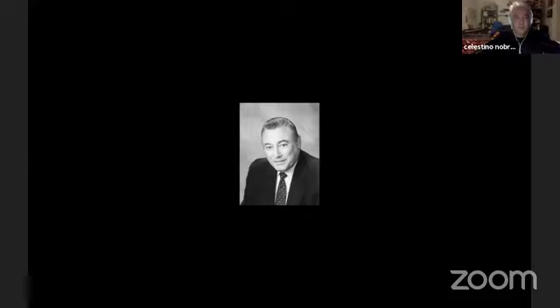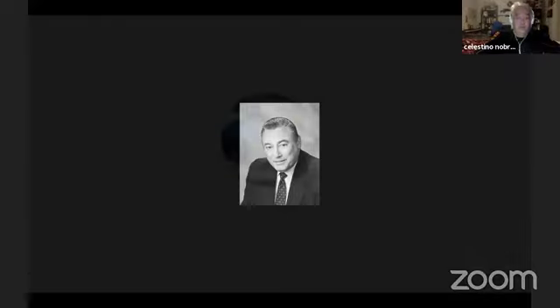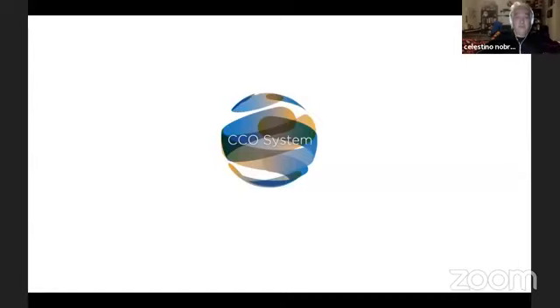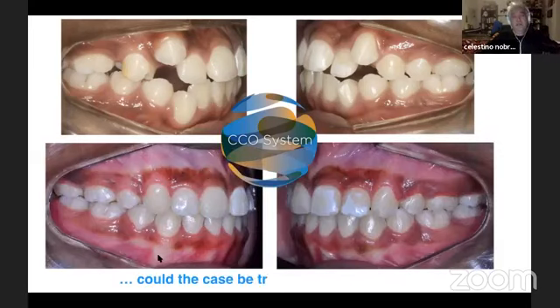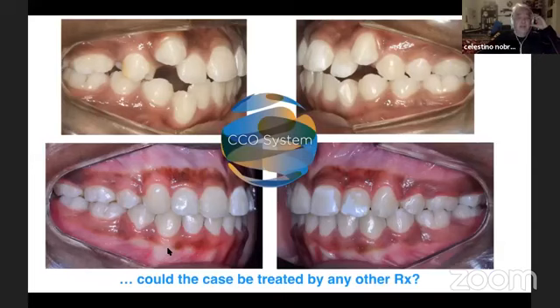So this is Ron Roth. I worked with Ron Roth for 12 years. And we created the CCO prescription because the Roth prescription is good for conventional brackets, not for interactive. But take a look. This is my question. I showed this case here from here to here. Could the case be treated by any other prescription or any other bracket? Yes or no? Of course, yes.